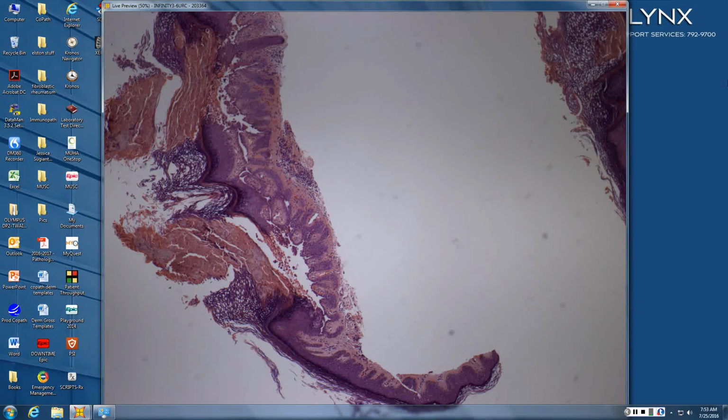EHK? Yes. But this... No. is more... But the acantholytic. No, it's the acanthoma one. So like an acantholytic acanthoma. Or it could be, it's a little big for Grover's, so it could be a small warty dyskeratoma, a big Grover's, someone with Darier's, any of the things that have acantholytic dyskeratosis.